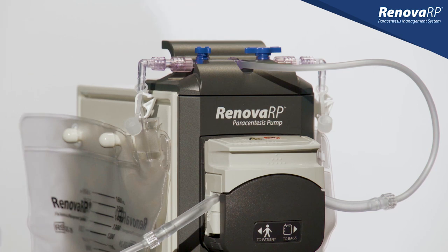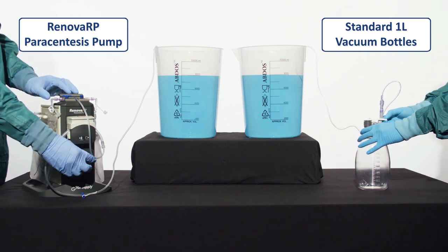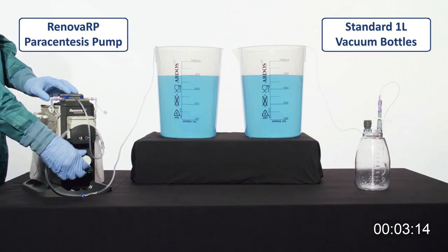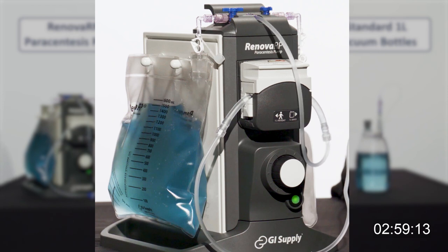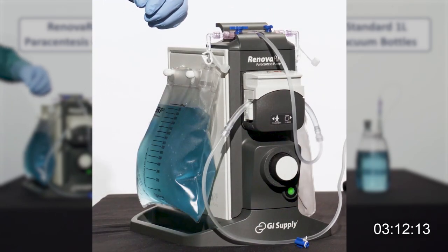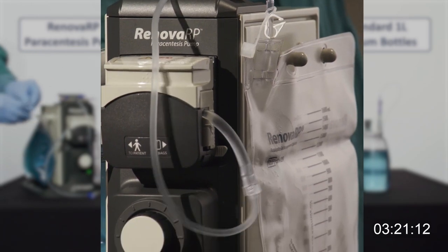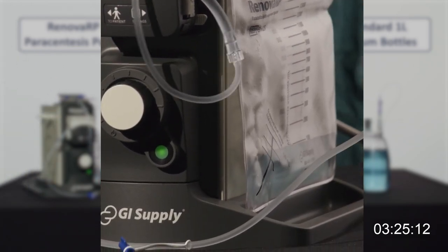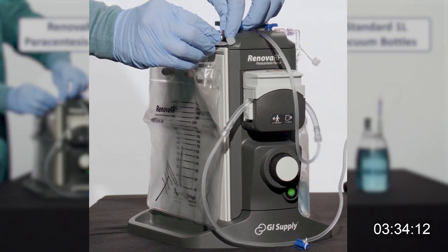Both the Renova drainage tubing and the bottle drainage tubing are connected to a standard 5 French 10-centimeter catheter. At three minutes, the Renova bag is almost full at roughly 1.5 liters. At the same timestamp, the plastic bottle has drained approximately 875 milliliters. Because the Renova RP uses a two-bag system, fluid will continue to drain while you replace the full bag. By simply opening the corresponding stopcock, the flow of fluid switches to the other side. Once the empty bag begins to fill, the full bag can be removed and replaced. Since the procedure doesn't have to be stopped to change drainage containers, you save time and improve overall efficiency.